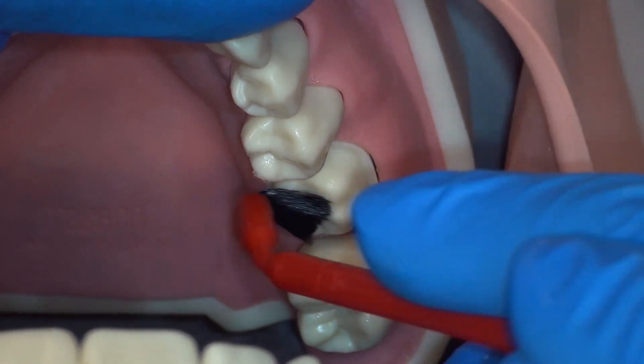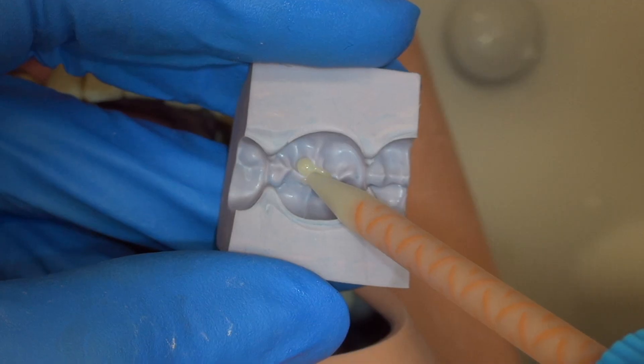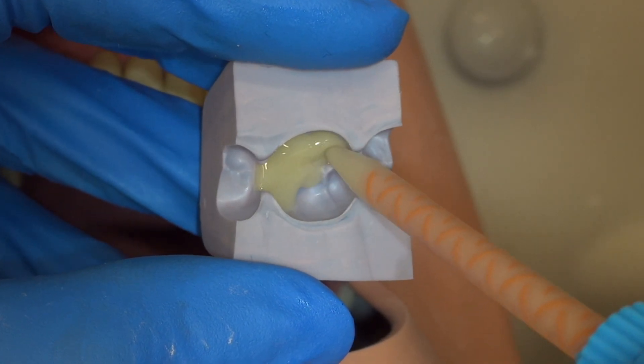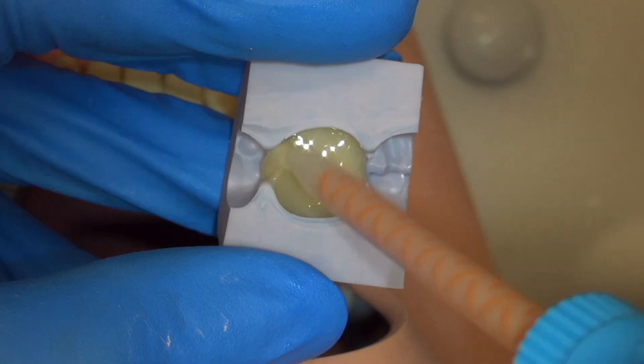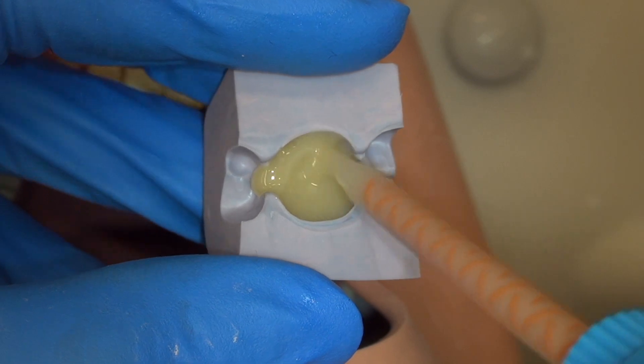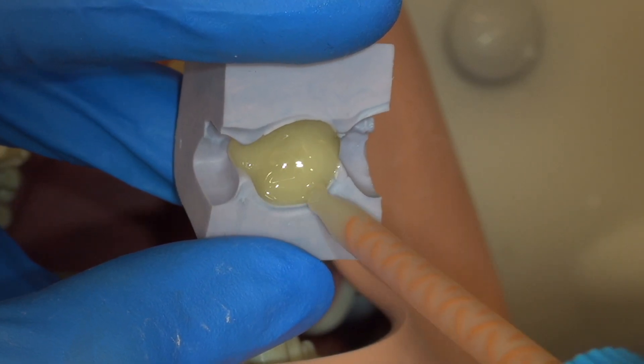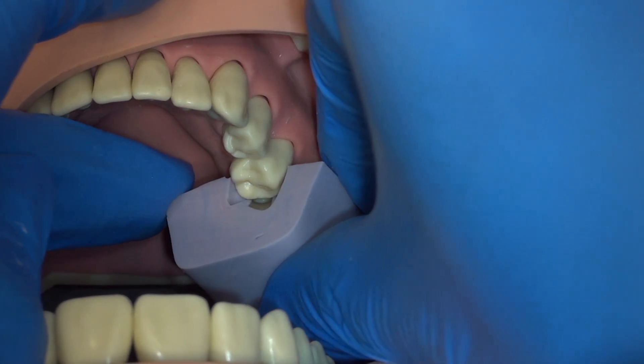Apply separator to the adjacent teeth and to the gingiva. We are now ready to fill our putty. Here we use bisgma integrity material, and while dispensing we do not lift the tip out as that can introduce bubbles. You don't have to fill your putty all the way, but it is a good idea to drag material all the way up to the edges circumferentially.